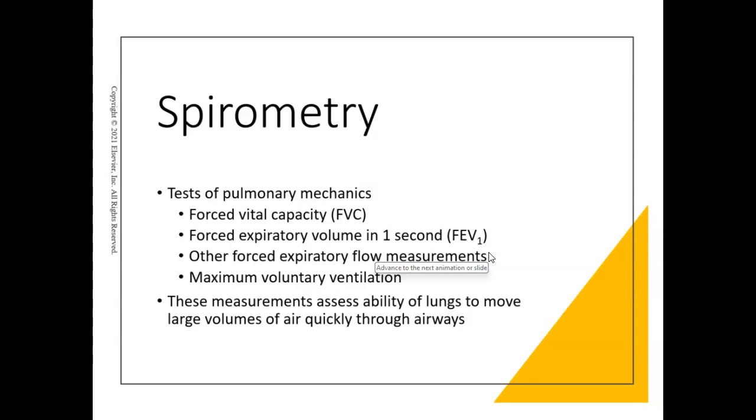Typically this test needs to be done at least 3 times to get reliability. I need 3 measurements, and those measurements need to be within 5% of each other to be considered reproducible or valid.